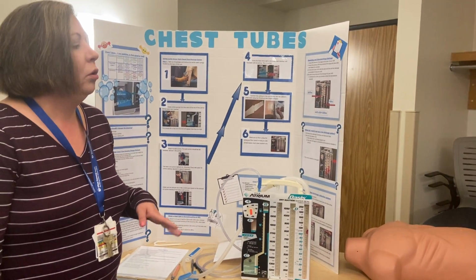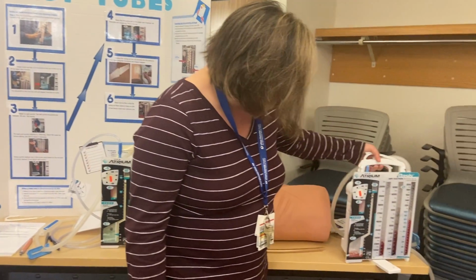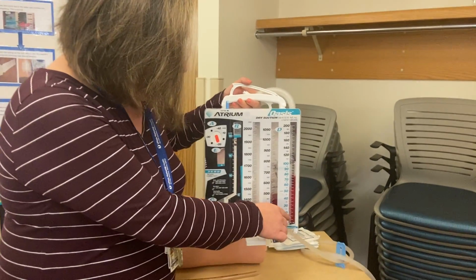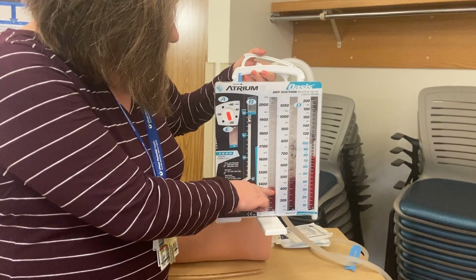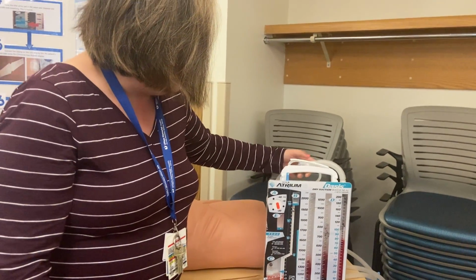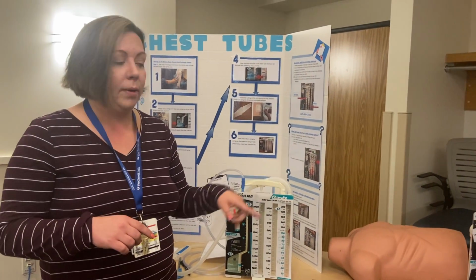One thing you want to make sure is not to tip over the canister. If you tip over the canister, it could look a little something like this. And this means this was tipped because you see how this column's partially filled and this one and this one. So if that happens though, it's okay. It's just not ideal. We want to change the canister around if that happens.